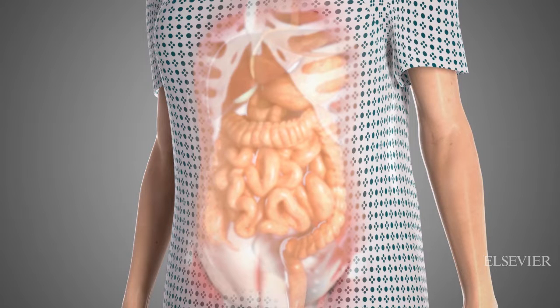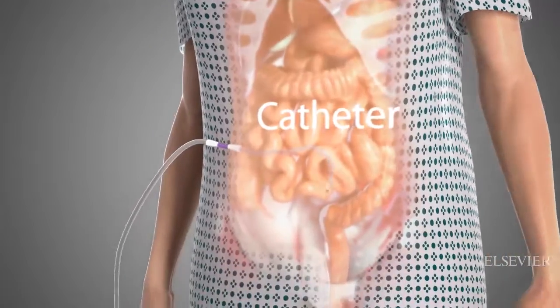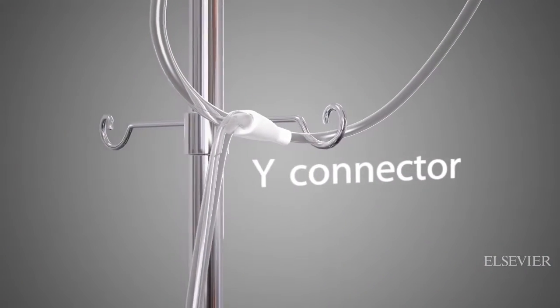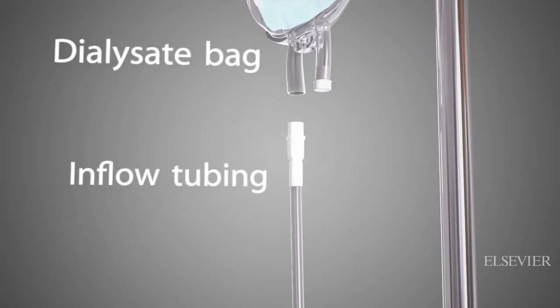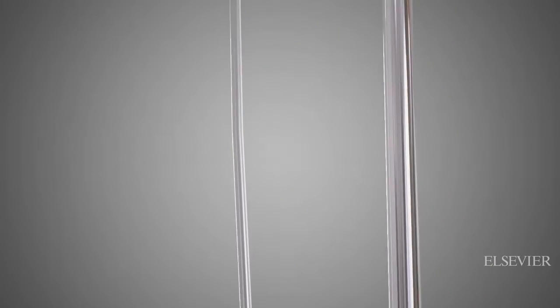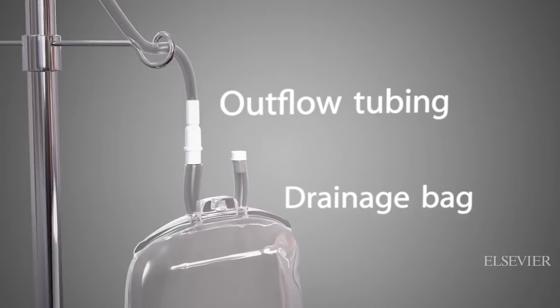Peritoneal dialysis requires surgical placement of a rubber catheter into the abdominal cavity. The catheter is connected to inflow and outflow tubing with a Y connector. The inflow tubing is connected to a dialysate bag, and the outflow tube is connected to a drainage bag.